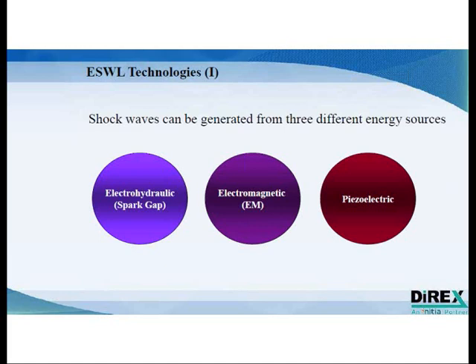Later came the electromagnetic generators, which operate at lower energy levels, which allow you to treat the patients with less sedation, and nowadays with no sedation, but also come with a disadvantage, which is the smaller focal area.